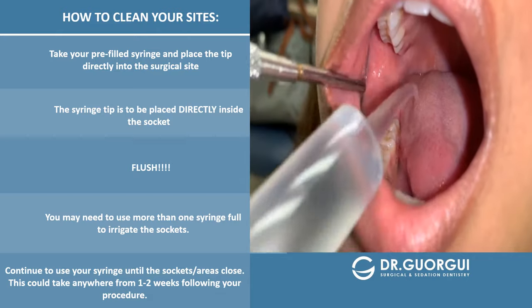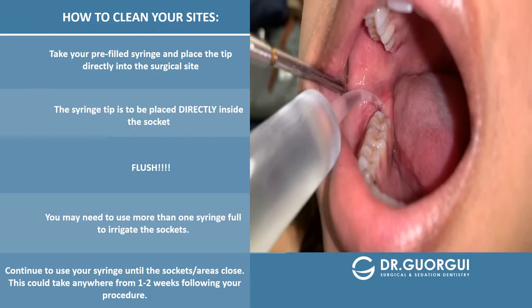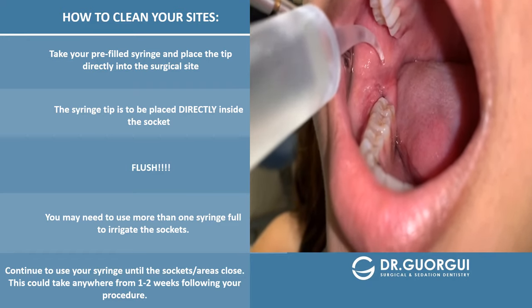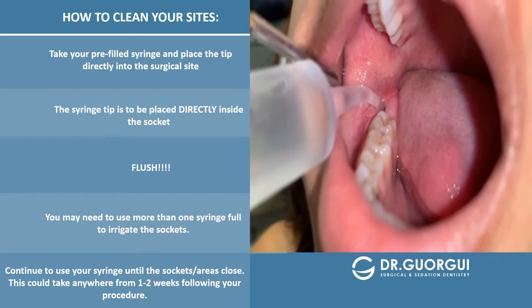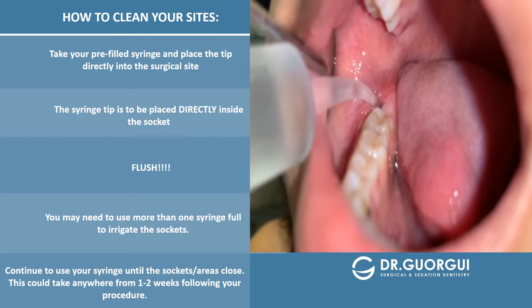You're going to take your pre-filled syringe. Using the tip, you want to get around the back molar like this. You don't want to hover on top but rather get the tip directly inside the hole. Doing so will ensure that all of the food particles will come out.